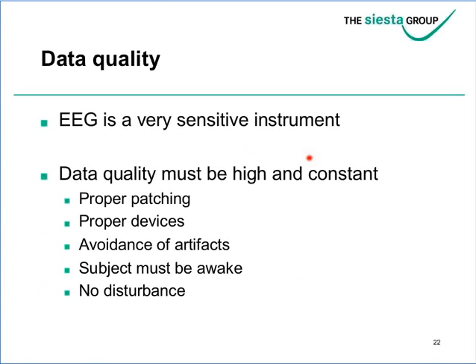Now, the final point I would like to make is that, of course, EEG, since it can answer very many interesting questions, is a very sensitive instrument, sometimes even too sensitive, in the sense that it can pick up other things as well. And therefore, it's of utmost importance in your trial that the data quality is high and constant.